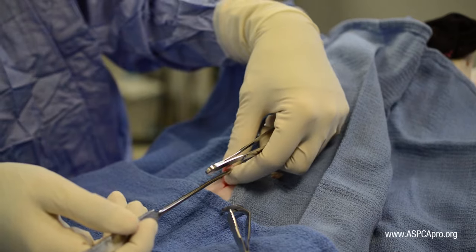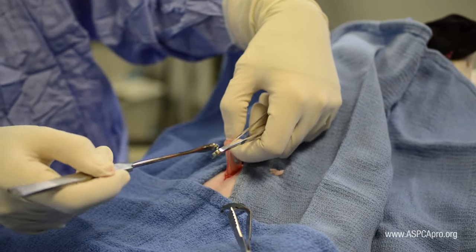If either of these structures are identified, gently grasp the structure between the thumb and first finger.